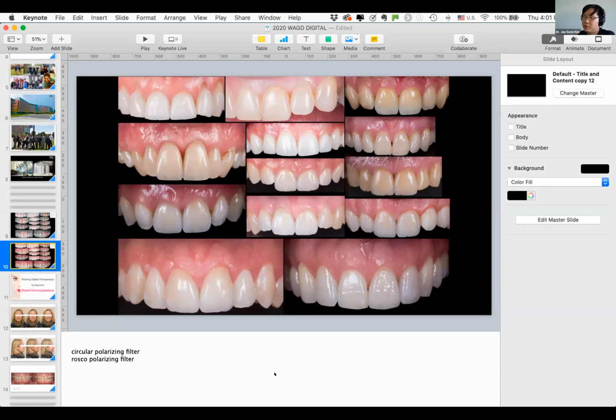Most of the time, if you're taking a buccal shot and the photo is dark, it's because one of the flashes is not reaching the area that you're photographing. That's one of the great things about the flash systems that I use: you can change the position of the flash, and you can put two together. If you point it towards the mirror that you're taking, it illuminates that area a lot better. So I would change the position of the flash.